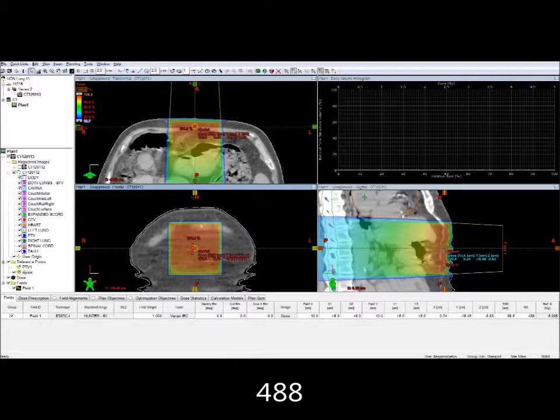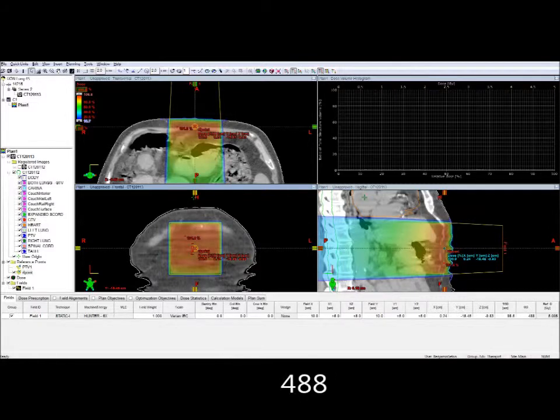There will be some slight differences between the monitor units because of contour differences. As you can see on the sagittal view, there's a gradient going from the left side to the right side, which is the patient's right to left side.